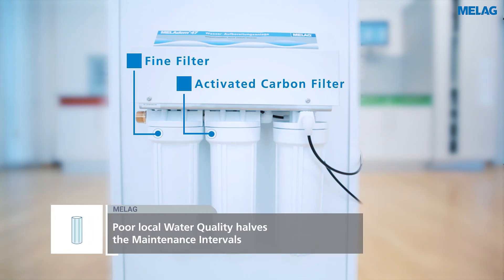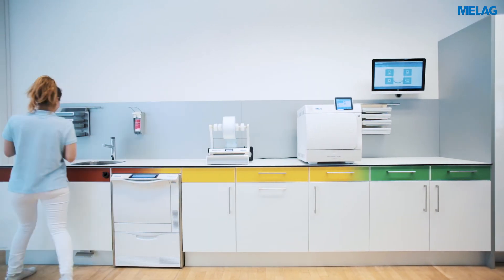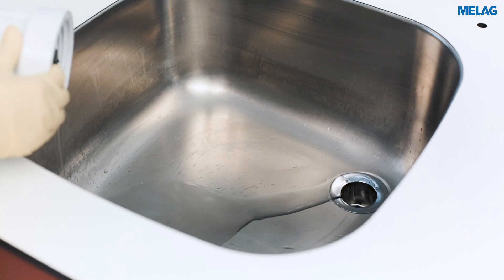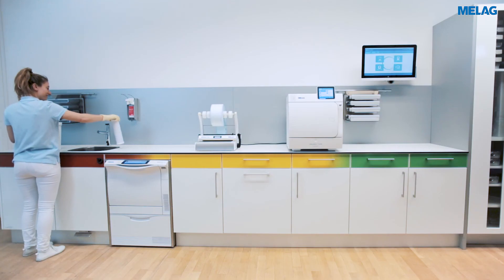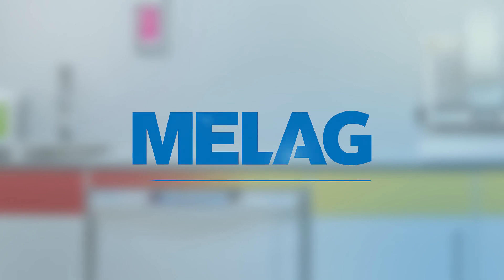In addition, please change the fine filter and the activated carbon filter once a year. Pour the water in the container into the drain and rinse the container housing thoroughly with tap water. Otherwise, please follow the process already presented in this video.